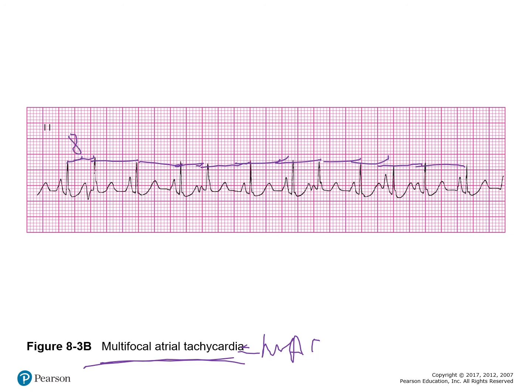So we're going to say 5, 6, 7, 8, 9, 13, 13, 7, 13, 13, 7, 12, 5, 10, 5, 10, 13. So we know this is irregular because there's no rhyme or reason to it. Irregular rhythm.